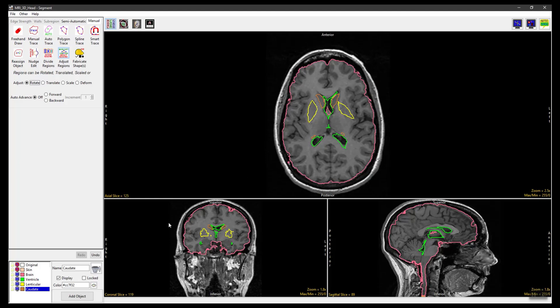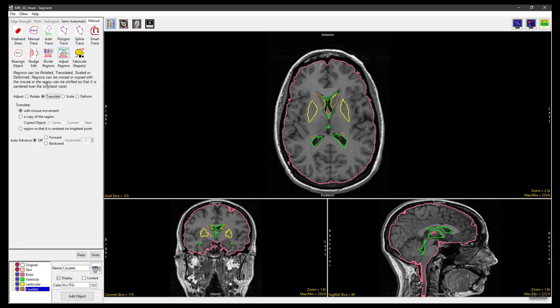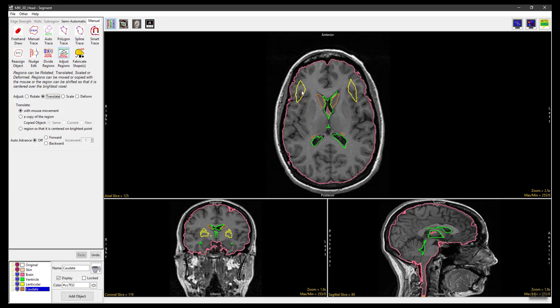Click Undo and set the Adjust Method to Translate. With the Translate option set to With Mouse Movement, click in an object and drag to a new location. Release the mouse button to end the translation. The object will be moved to the new location.